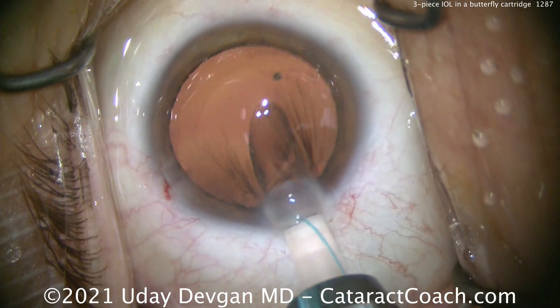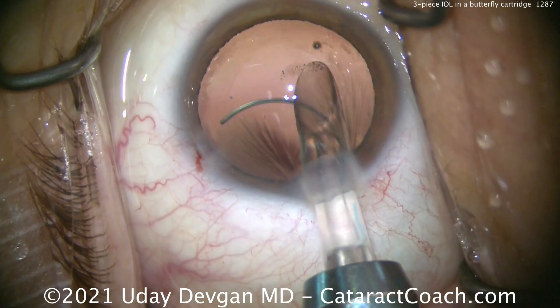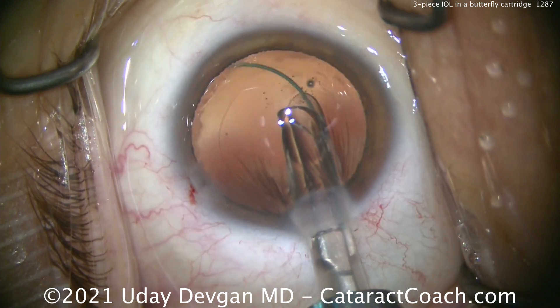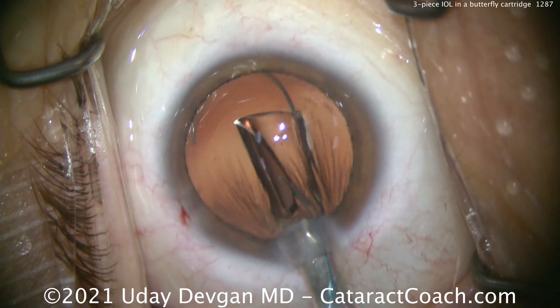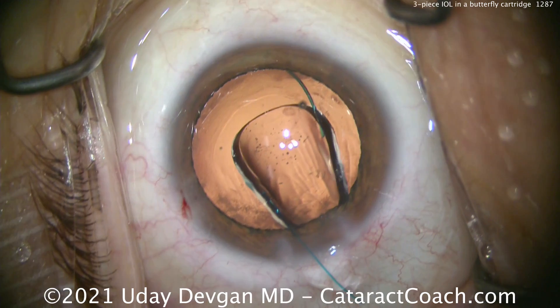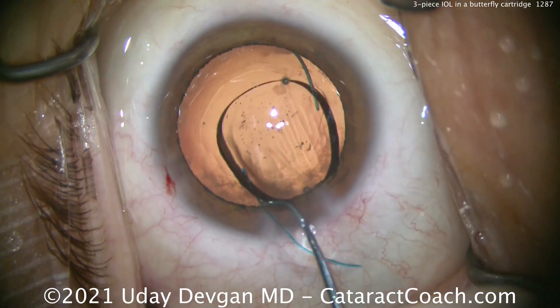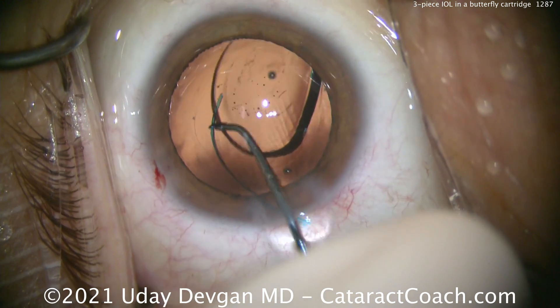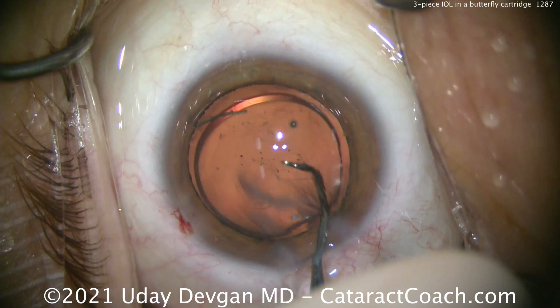Remember the 7L rule: the first haptic must come out like the number seven — correct orientation going into the bag. The optic then unfolds nicely into the bag as well. The trailing haptic should look like the capital letter L — so: 7L rule. The lens as a whole should be in the anti-S orientation. Never let the lens look like the letter S, because that is wrong.